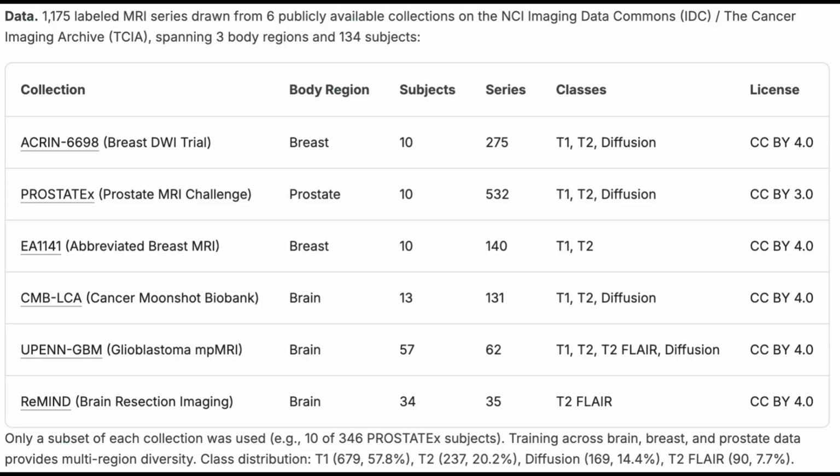MedSigLip's ability to accurately classify MRI sequence weighting by pixel data may be the answer to multiple problems. Being able to efficiently classify regardless of metadata availability is a powerful tool to leverage. We utilize publicly available DICOM images for all training and testing.